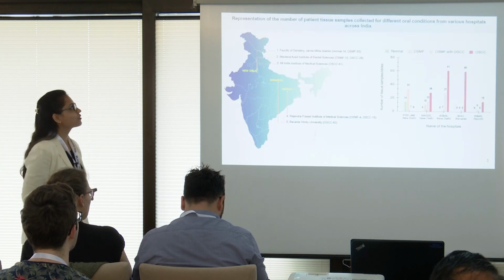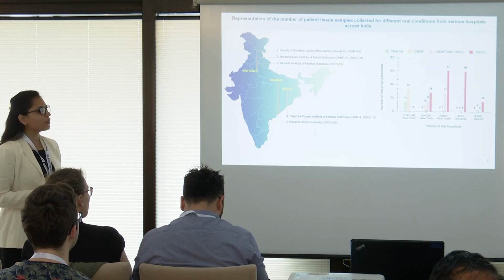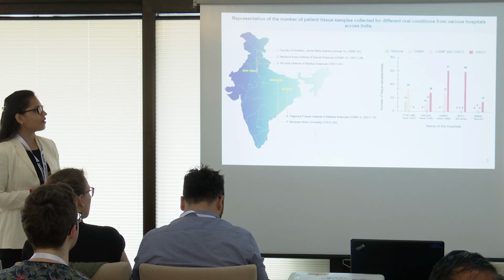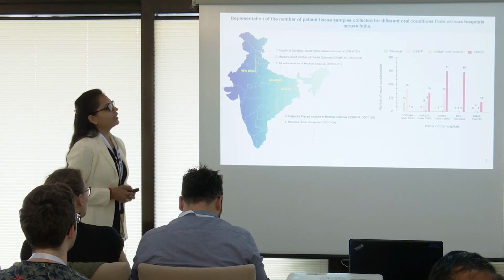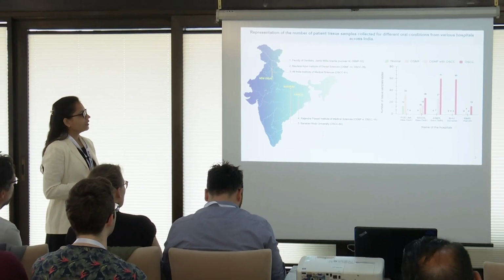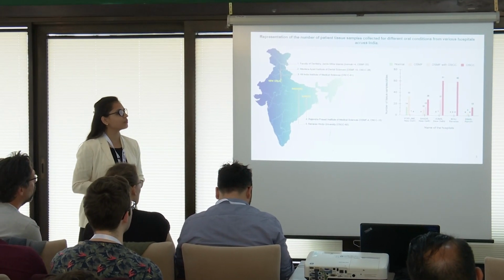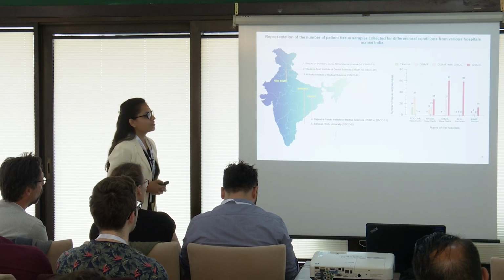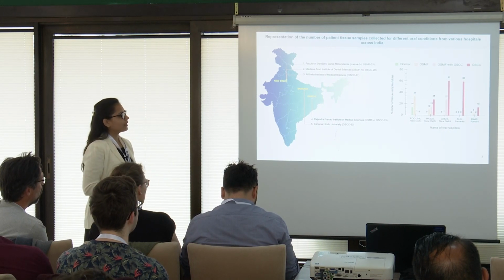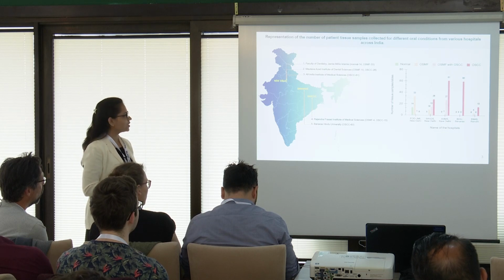to the patients. To proceed with the research study, we collected the samples from 5 different institutes across the Indian subcontinent, which include FOD JMI New Delhi, MAIDS New Delhi, AIIMS New Delhi, BHU Banaras, and RIMS Ranchi. The samples were collected in the form of tissue samples and also in the form of digital pathology images.